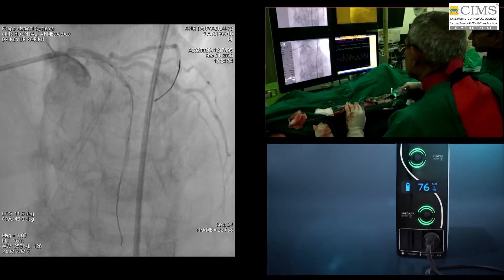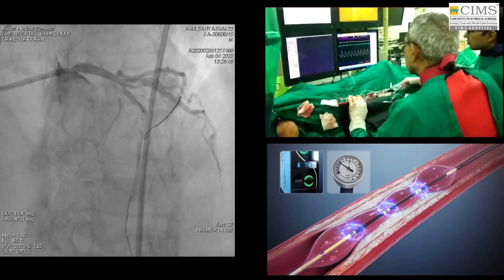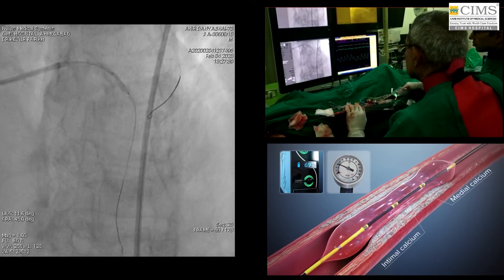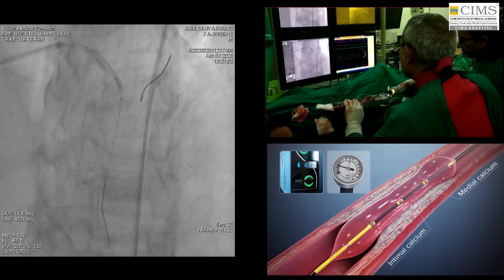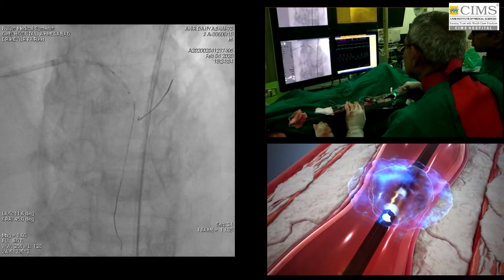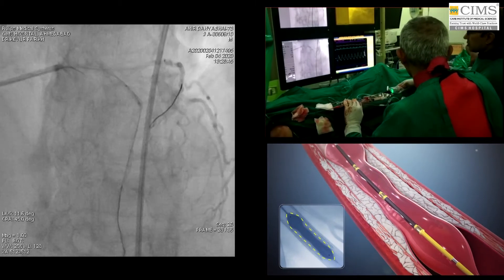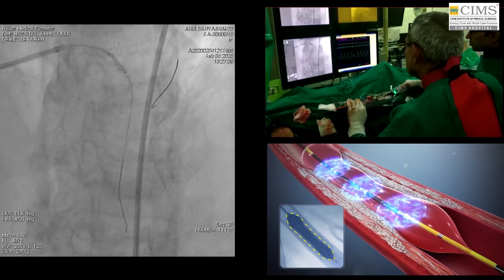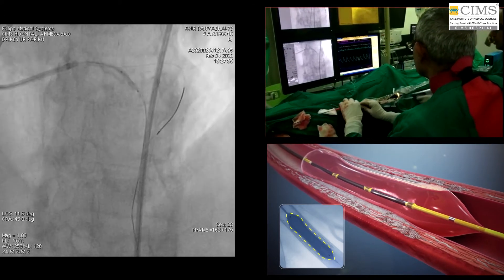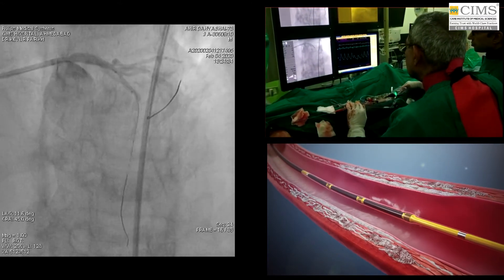The generator produces 3 kilovolts of energy that travels through the connector cable and catheter to the lithotripsy emitters once per second. While other treatments cannot differentiate between calcium and soft tissue, acoustic pressure waves pass through soft tissue to impact both intimal and medial calcium. With emitters along the length of the balloon, a localized field effect is created. A small electrical discharge at the emitters vaporizes the fluid within the balloon to create a rapidly expanding bubble that generates sonic pressure waves, which then collapse within a few microseconds. When the waves impact the calcium at nearly 50 atmospheres, they create a series of micro-fractures. After calcium has been fractured and trauma to surrounding soft tissue has been minimized, the vessel becomes more compliant, and the operator can proceed with the preferred treatment strategy.